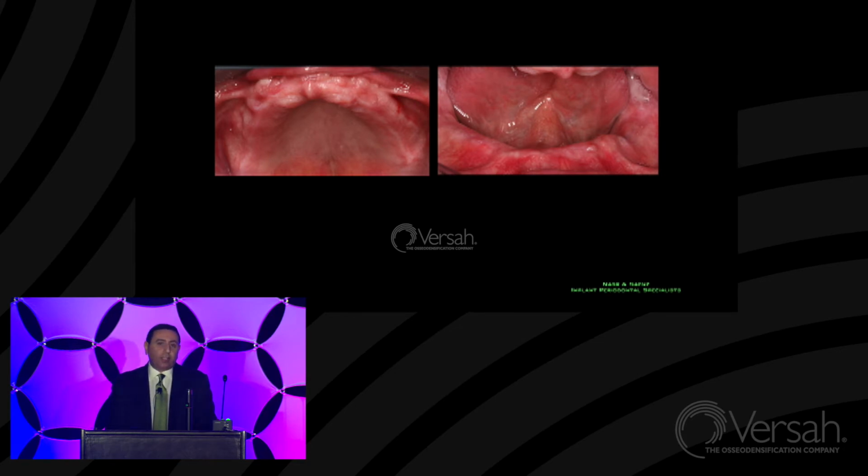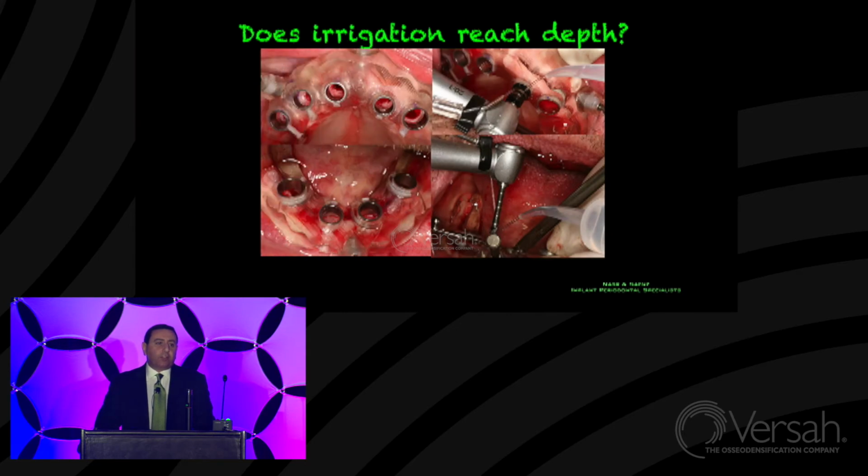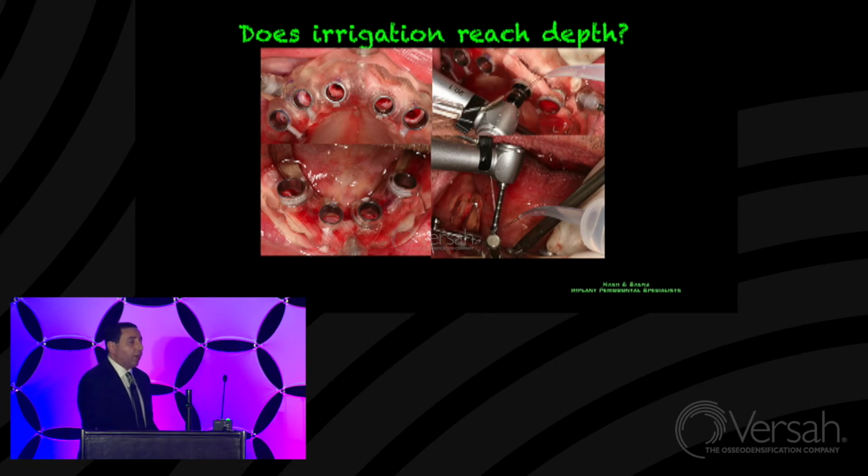In the mandible, he had a large mandible, and in the planning, we decided to place very long implants because we were concerned about the occlusion, which he had problems with before he had lost his teeth. These implants were 18 millimeters in length on the angled implants and 15 millimeters in the central area of the jaw. So here's the hardware.